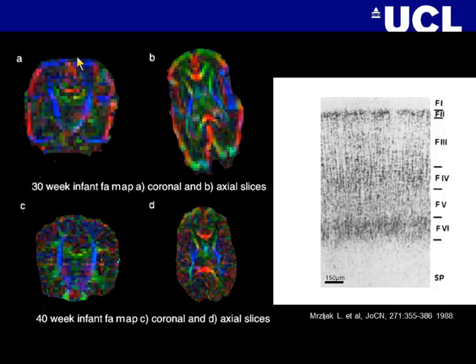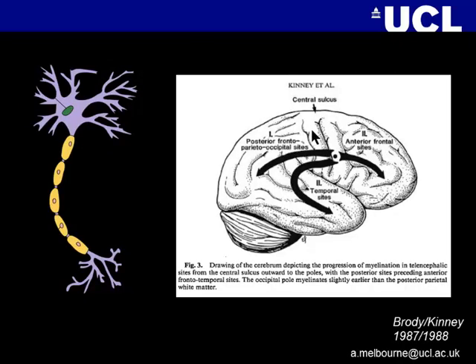So you can do some standard diffusion tensor imaging, and then you'll get these very nice color maps, which eventually change when the brain matures. The change in this is mostly due to the reduction of the fractional anisotropy. The water diffusion becomes less directional when the brain matures, while the white matter tracts start to form, and this is well known from pathology. One interesting thing is this really happens through myelination of the cortex, and the brain doesn't get all myelinated and mature at the same time.